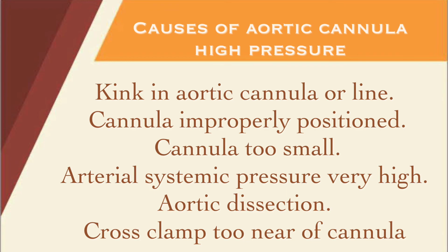Causes of high pressure in the aortic cannula: kink in the aortic cannula or line, cannula improperly positioned, cannula too small, arterial systemic pressure very high, aortic dissection, clamp too near the cannula.